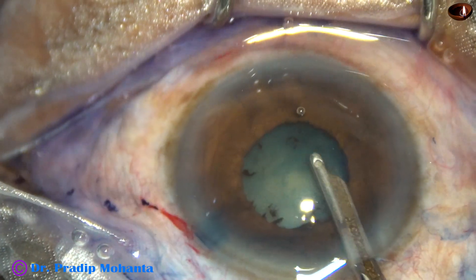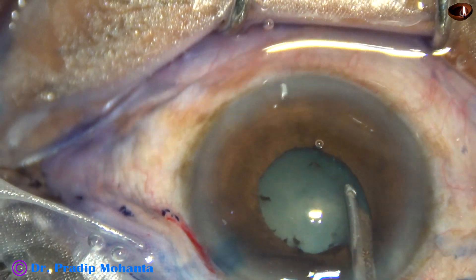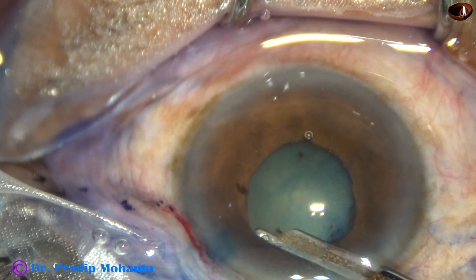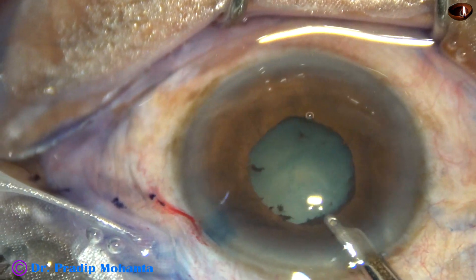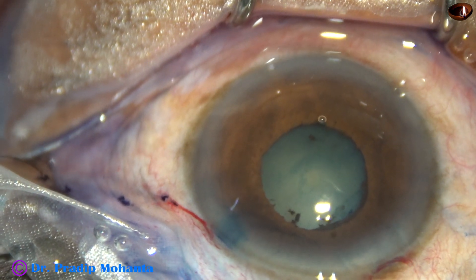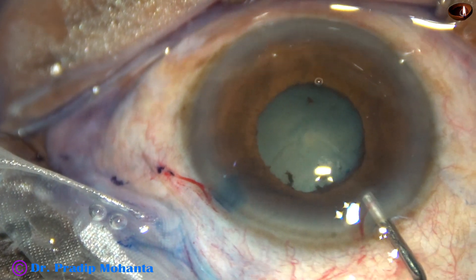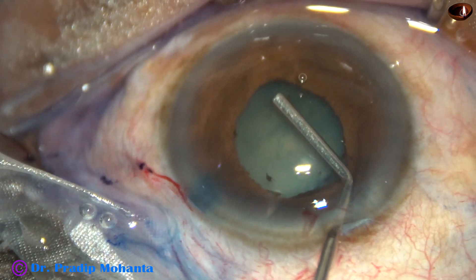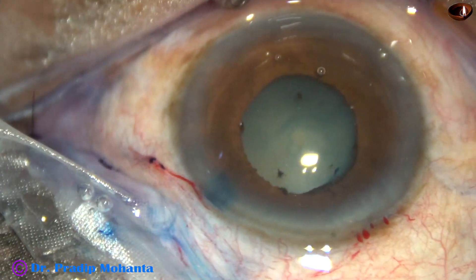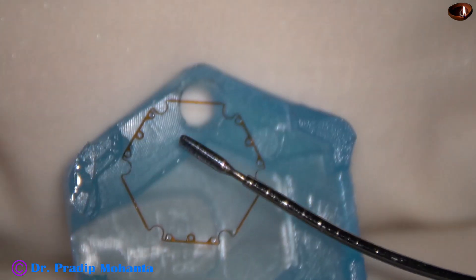We can see a lot of dye coming out. Washing the dye again to get a clear anterior chamber and clear view. Yes, after washing the dye, if we inject visco, the visibility is maximum. This is 2% hydroxypropyl methyl cellulose as the viscoelastic substance — the OVD. Now the size of the pupil is about 4 mm.